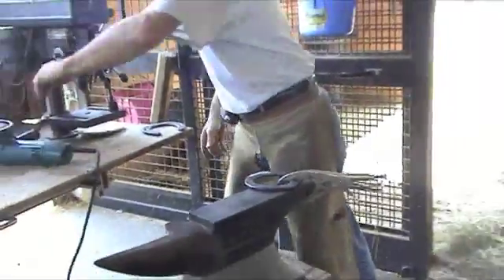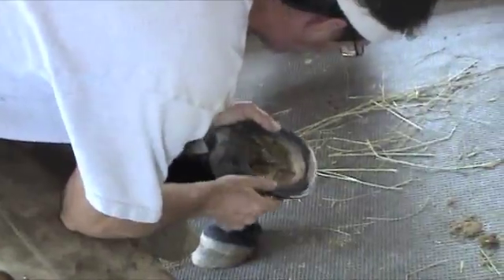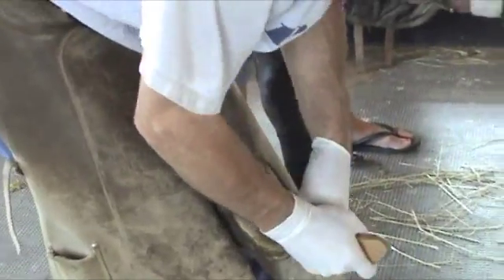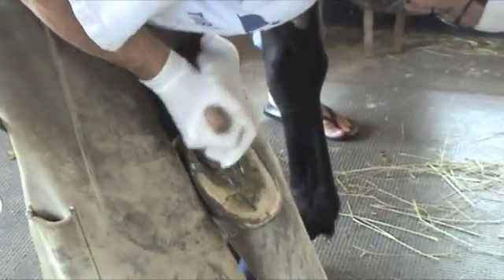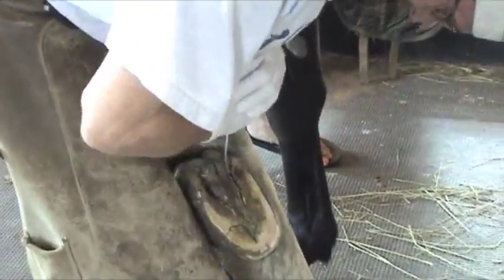So I took it back to the grinder. At this point I got the shoe sitting pretty flat, but there was no clearance at all. So when the horse was standing on the shoe, the sole would be pushing into it.